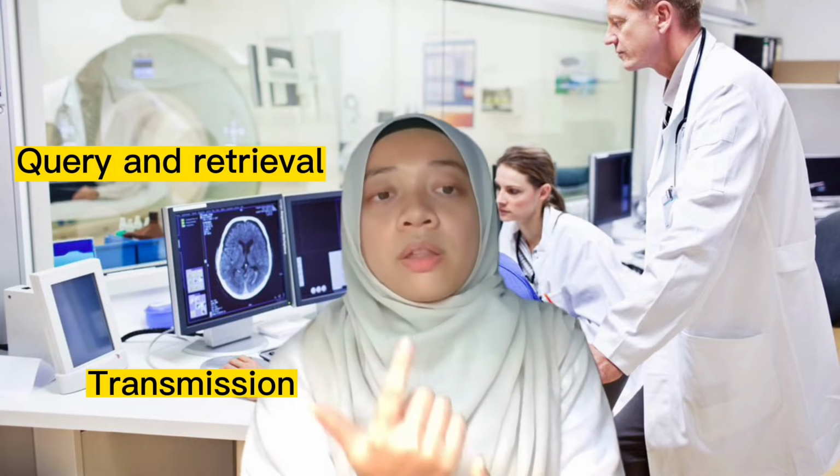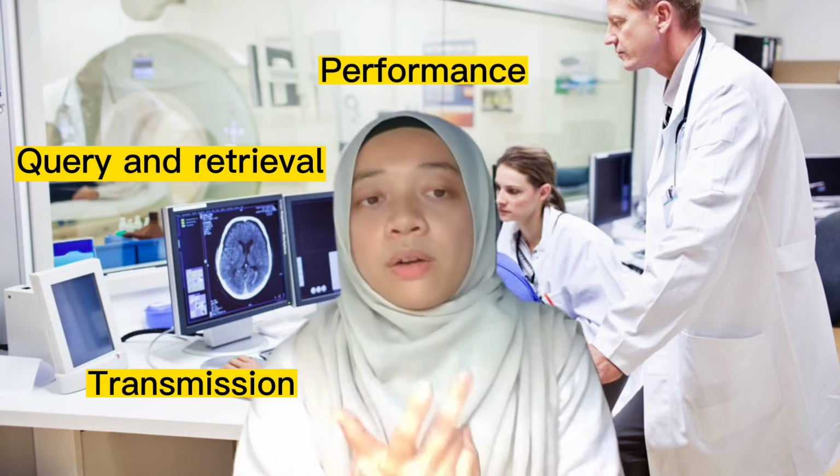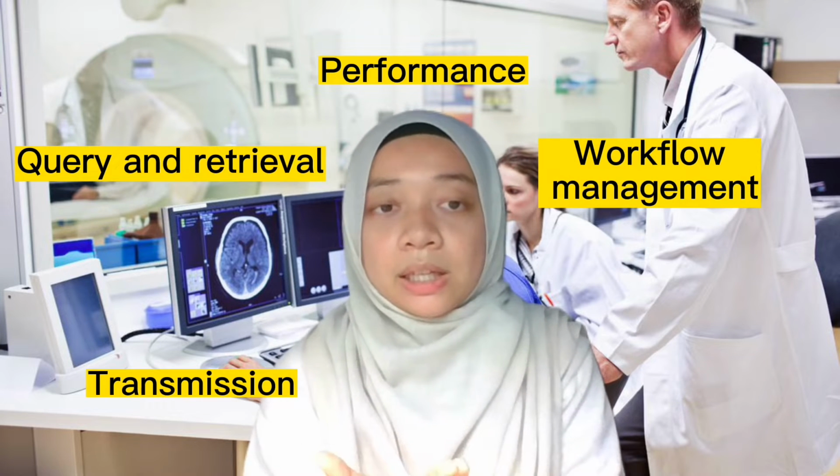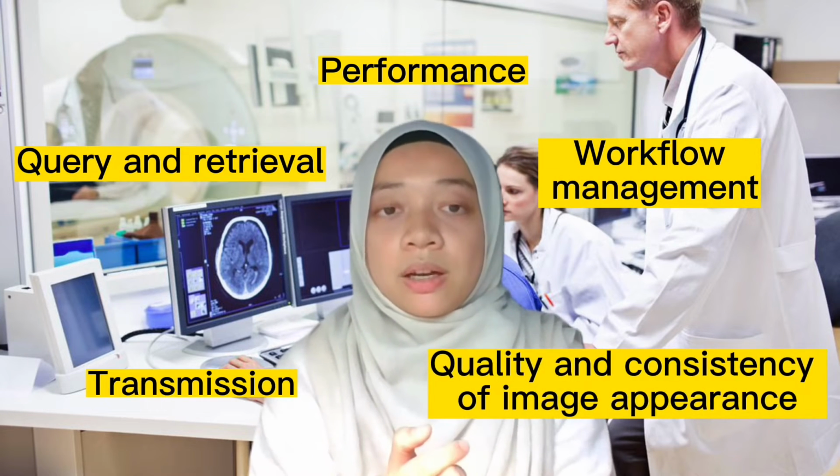There are 5 layers of functionality, which are: first, transmission; second, query and retrieval; third, performance; fourth, workflow management; and lastly, quality and consistency of image appearance.